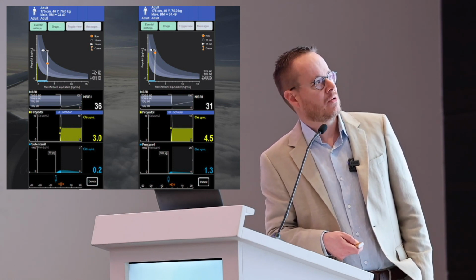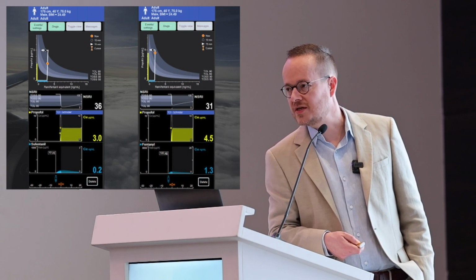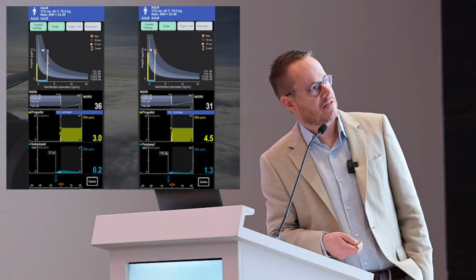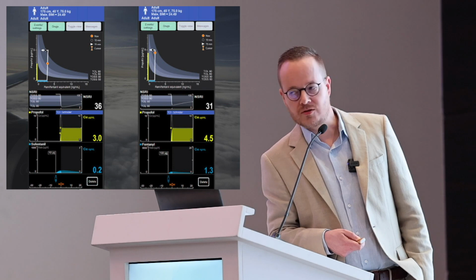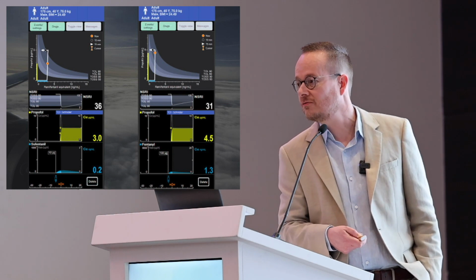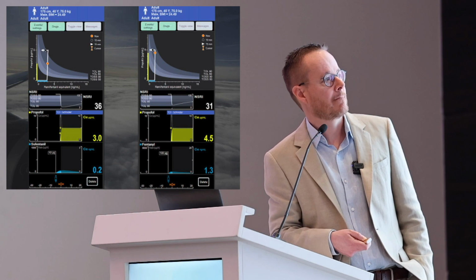We can see a lot of things already. First, if you only give opioid, there is no question of synergy. So we will just stay on this x-axis, and we will never be even close to the isoboles. No matter how much opioid you give, you will never reach TOS. Your patient will die for sure, but you will never reach tolerance of shake and shout.